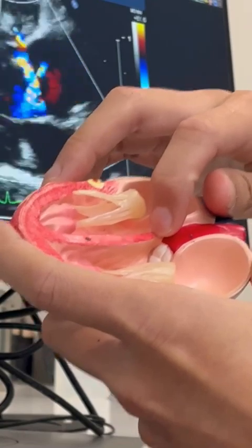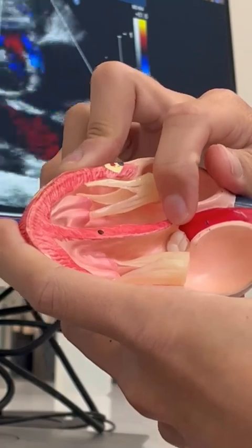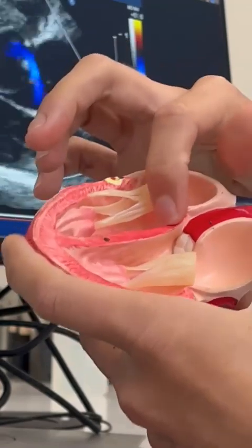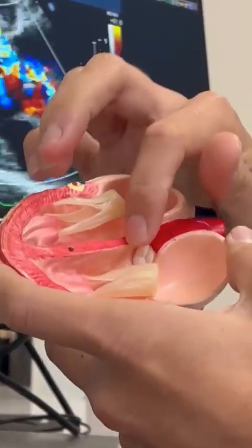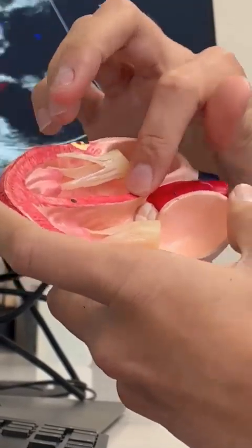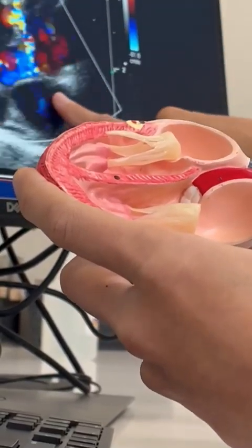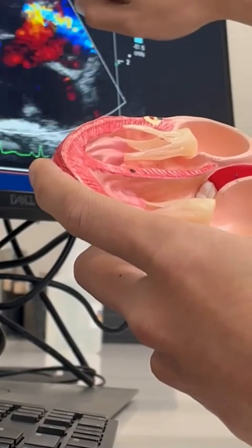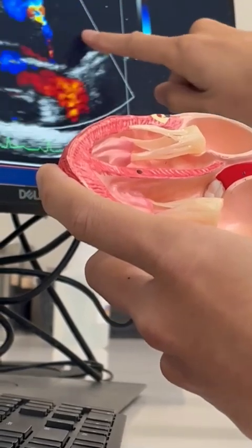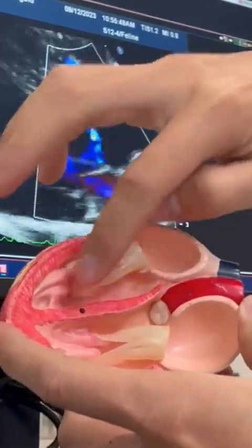That is called a ventricular septal defect, abbreviated as VSD. This is one of the defects that comprise the whole tetralogy of Fallot. So VSD is one of the abnormalities here, and the blood flow direction is going from the right lower chamber in this direction to the aorta here. Essentially the blood flow is going from here to here.